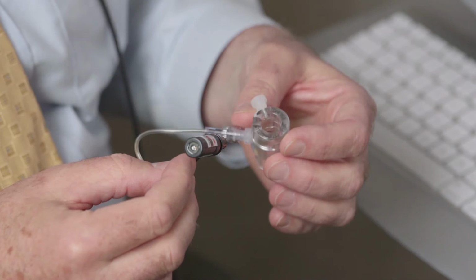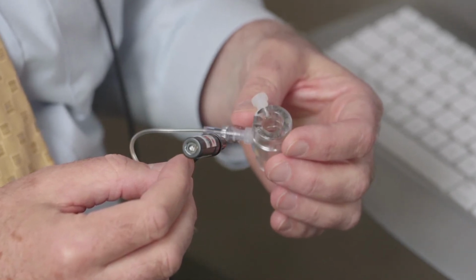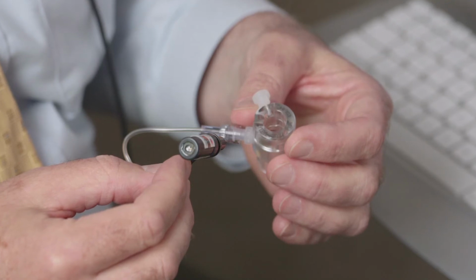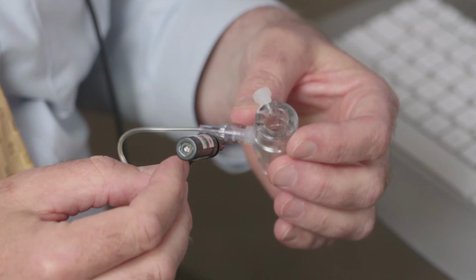For A-scan biometry of normal eyes, two methods of probe placement may be used. In the contact or applanation method, the probe is placed directly on the cornea. In the immersion method, the probe is placed over the cornea in a fluid interface contained by a scleral shell.